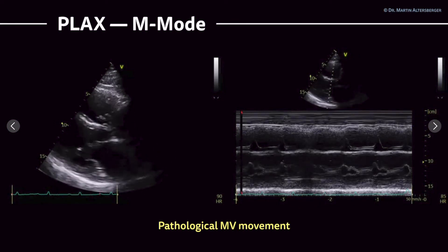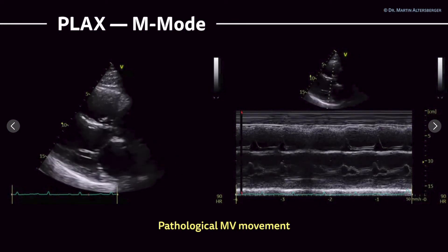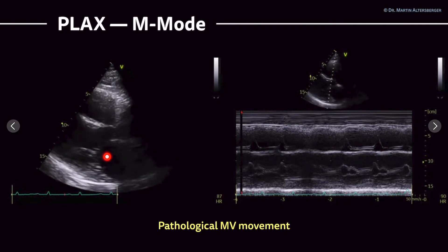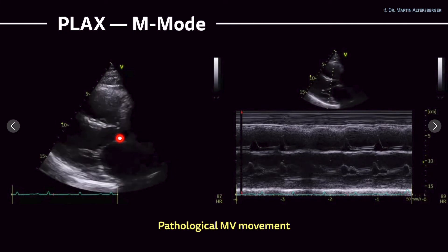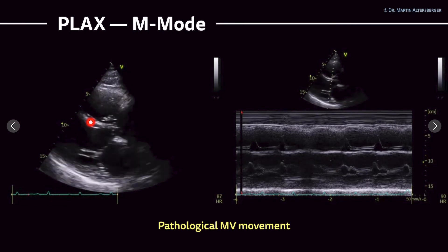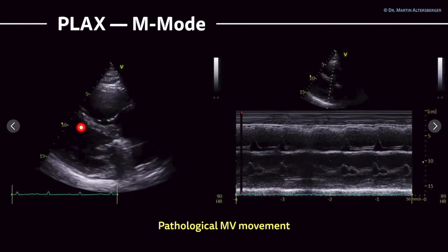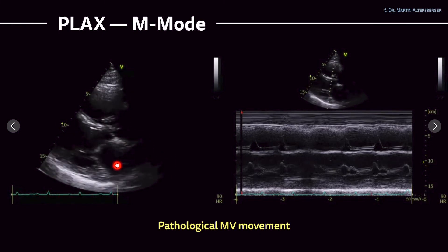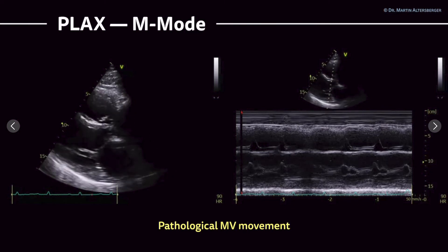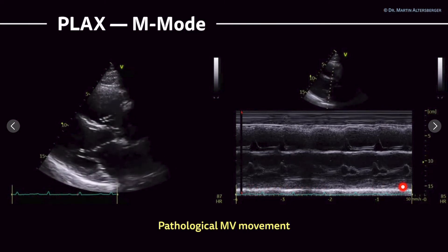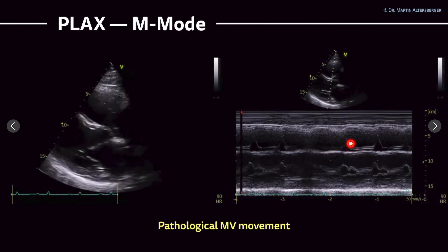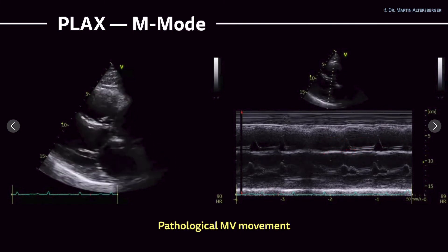We can also use the parasternal long axis view and M-mode to display the mitral valve. Here you see the mitral valve, the aortic valve to a certain degree, the tricuspid valve, the interventricular septum, the right ventricle, the left ventricle, and the left atrium. This is the pericardium, and this can also be seen in this M-mode study — here's the pericardium, the interventricular septum, the right ventricle, and you also see the tricuspid valve moving.